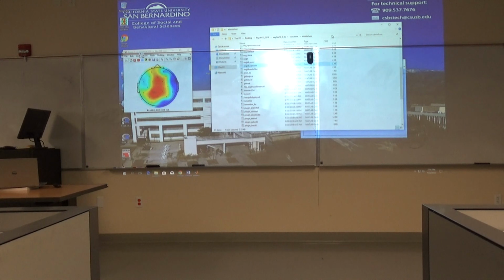What did you do again? Set the top. I'm looking at spots where you can paste that directory. Come back to your whatever it was, just like that. Now click the white space, right click, copy. Come back here. Paste.